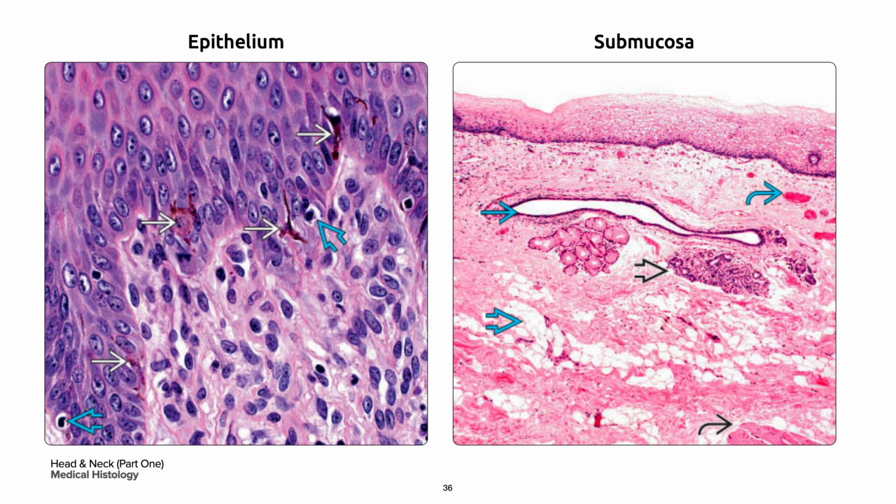On your left, the color of mucosa varies among individuals, much like the color of the skin. This H&E shows deposition of melanin in single white arrow along the basal layer of the epithelium. The number of melanocytes in a bold blue arrow found in the epithelium is generally consistent from one person to the next, despite color variation.